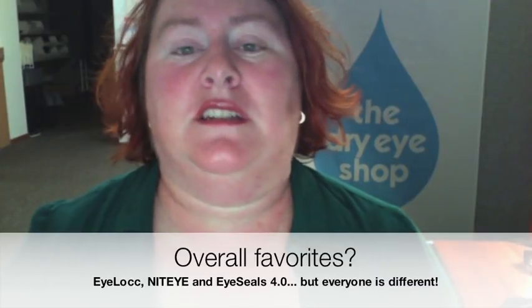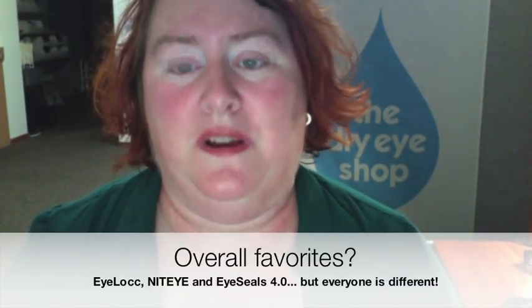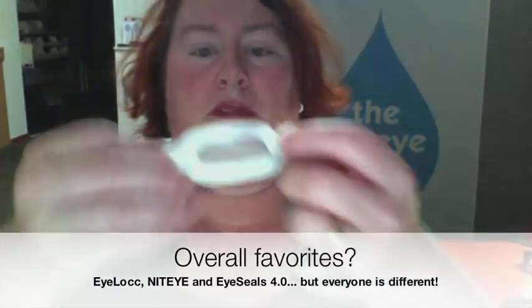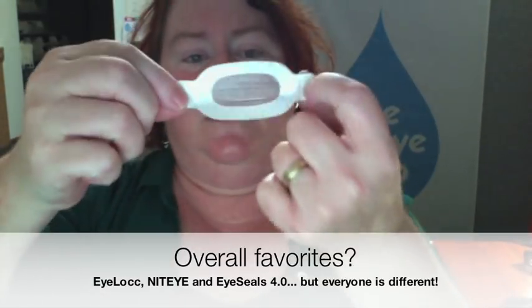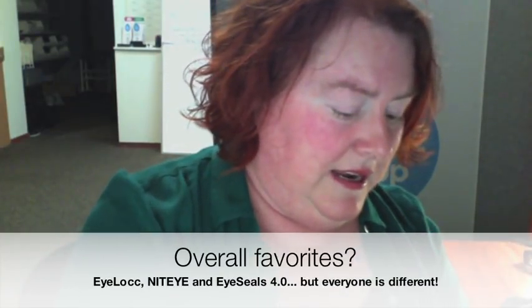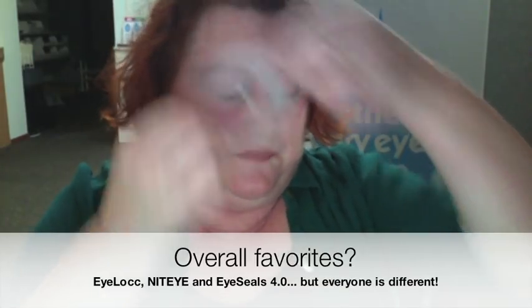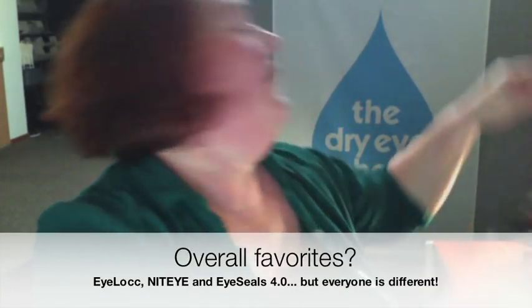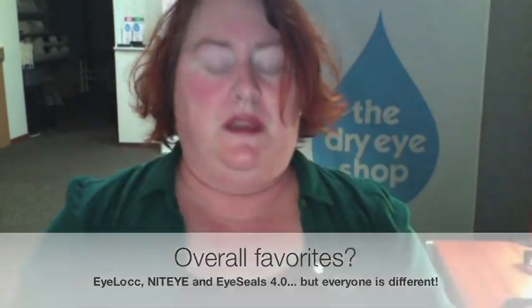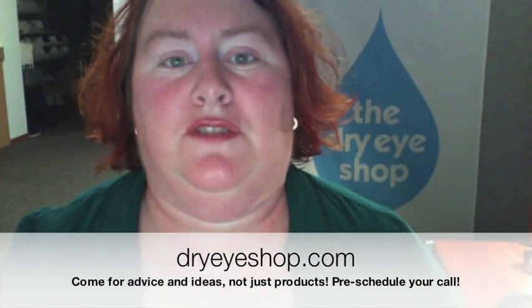So to sum up, the solution for a non-closing eyelid is going to be different for everyone. The most popular things I know are the Eyelock strips, the Nite Eye bandages, and the Eye Seals 4.0. All of the products I showed you are available at dryeyeshop.com.